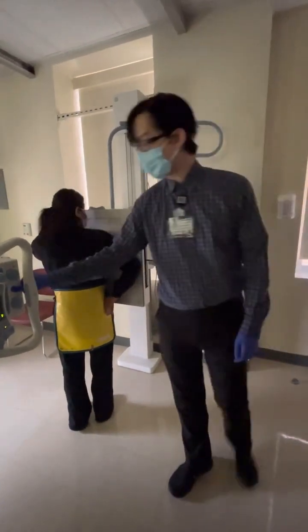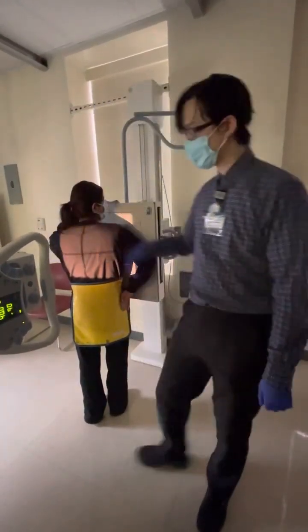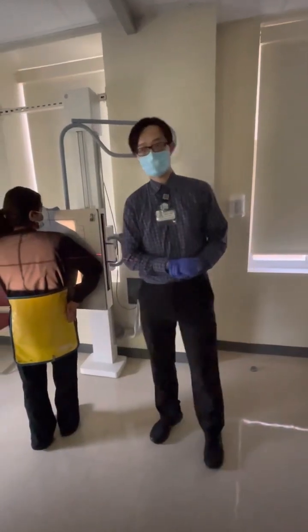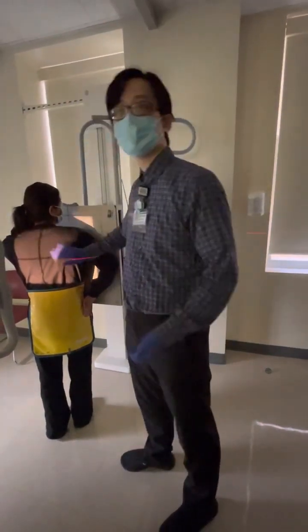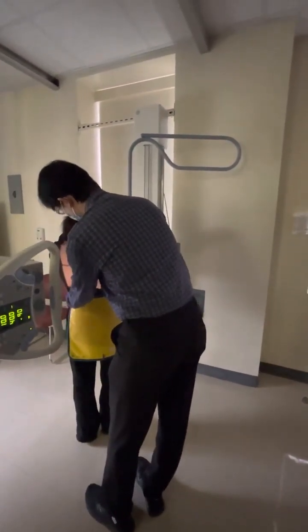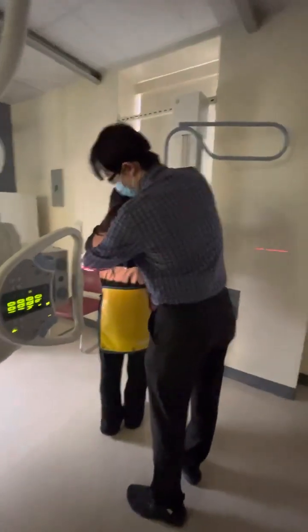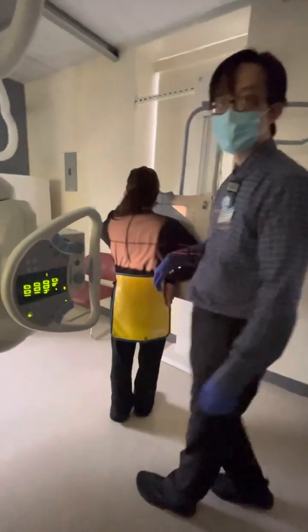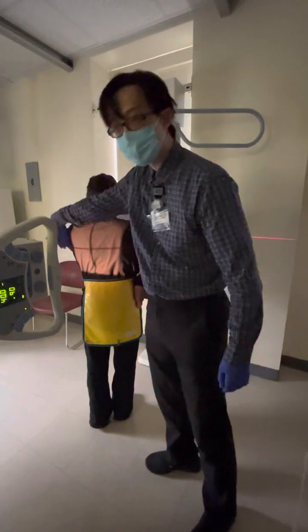Centering. We got our vertical centering, but now we need to do horizontal centering. So where do we center? This is going to depend on if you are doing unilateral or bilateral. If I am doing bilateral, if I want to get the entire thorax, both left and right side, I am going to just slide it back slightly. Just slide your shoulders over. Okay. MSP, MCP, right in between. So I'm going to have light on the left side, I'm going to have light on the right side. So this covers the entire thorax. I'm centering between MSP here and the MCP here on the side.